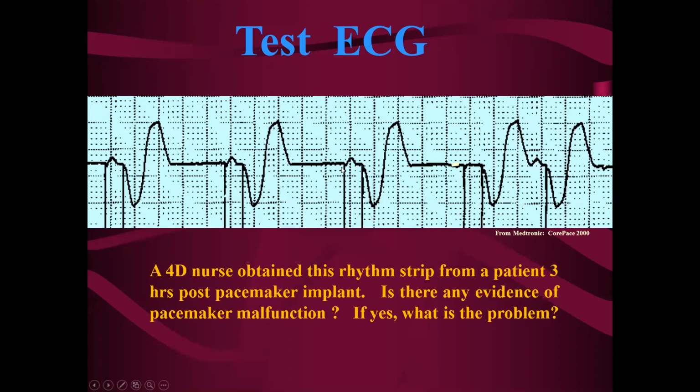Yep. So it's pacing both, but there's also one beat here that tells you that the pacemaker is also atrial sensing and tracking it, right? Yes, a sinus beat that came in and it pulled in the ventricular pacing as well too. Whereas DDI, remember that the I is only for inhibit from pacing, it won't be tracking. So by having this beat here where we can see that the pacemaker is tracking a sinus P wave, it tells you that it is DDD.